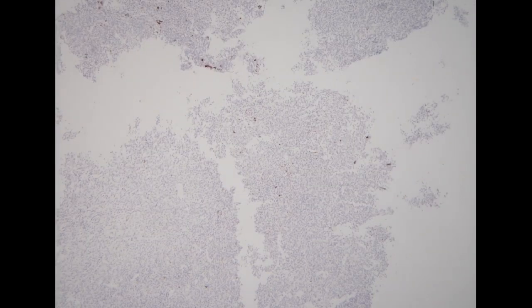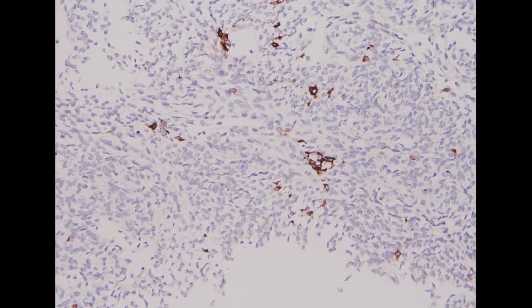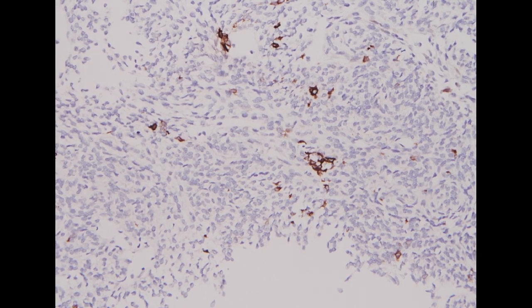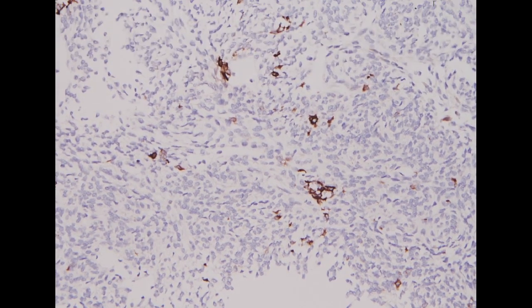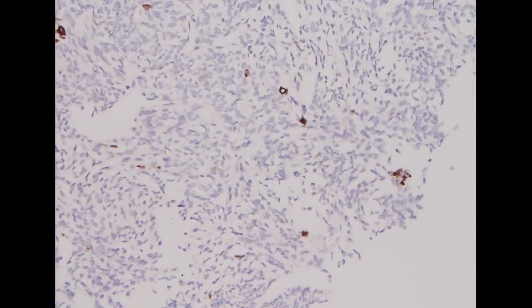For the synovial sarcoma, it is one of the sarcomas that can have this unusual, very patchy staining for CK. Even though this is a monophasic synovial sarcoma, not biphasic synovial sarcoma with more epithelial component, in this short spindle cell, you can appreciate they are very strongly stained, like very scattered cells positive for CK.